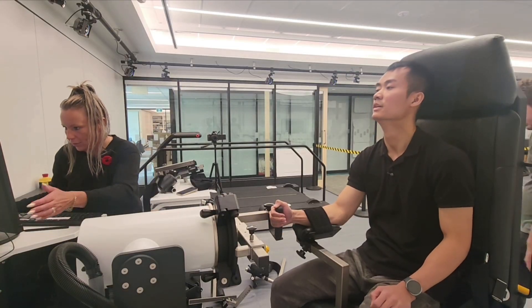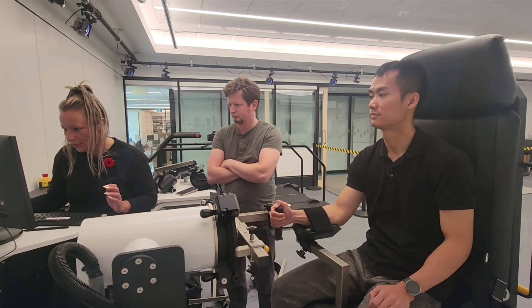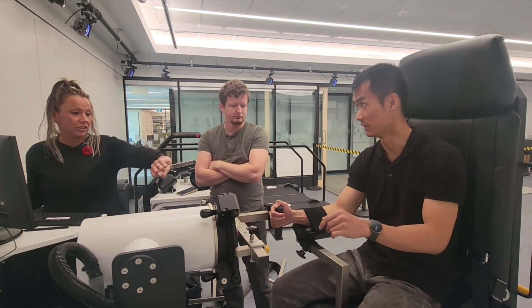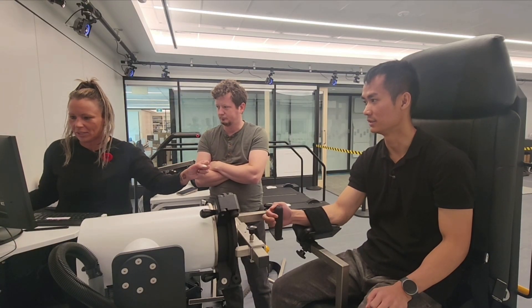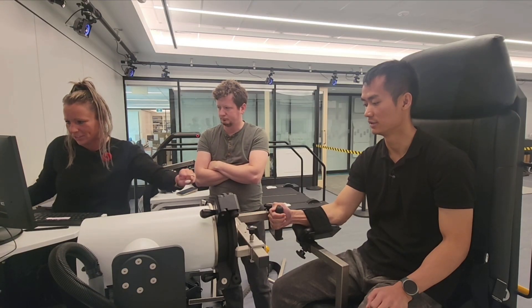Hopefully this works. So we did those, we got those, we can hit okay. It's gonna measure twisting. Yeah, I'm hoping it is. It's a little wonky right now — I might have to call the guy — but we're gonna set you up anyway so we can see if it works.